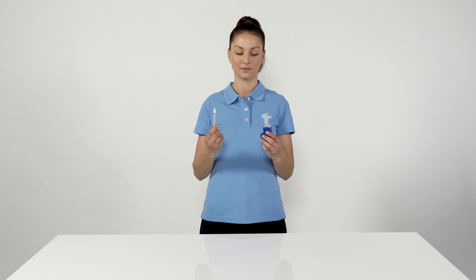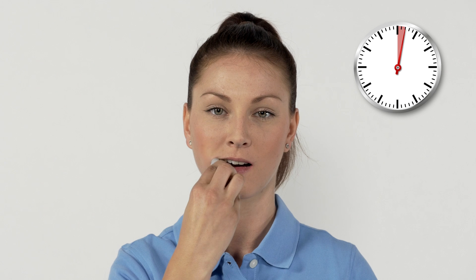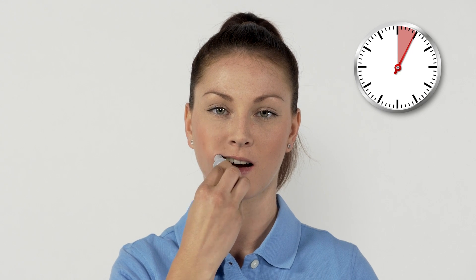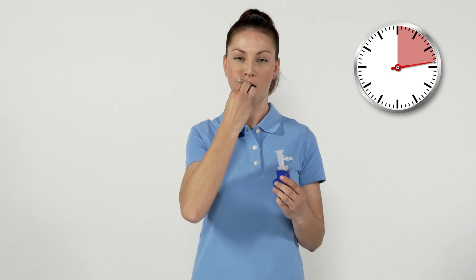To take a saliva sample, wipe the sampler back and forth for 10 to 15 seconds in the mouth, under the tongue, and in the cheek pouches. The sampler must not be sucked or chewed in the process. If the red indicator on the mouthpiece discolours before then, you can end the sample taking early.